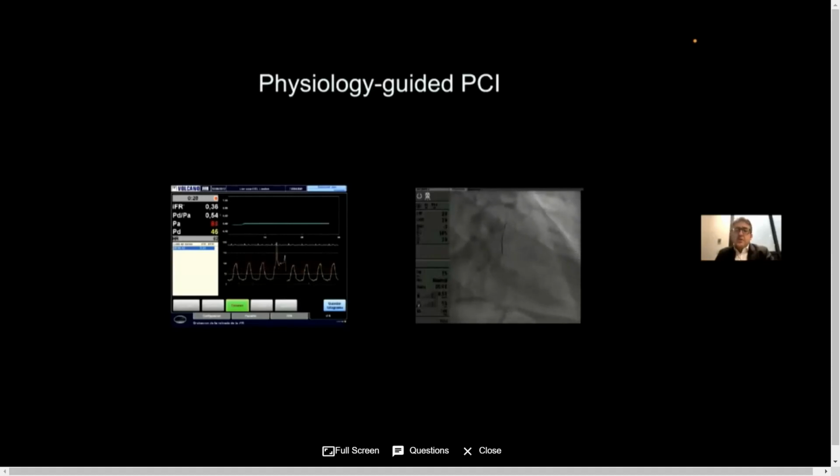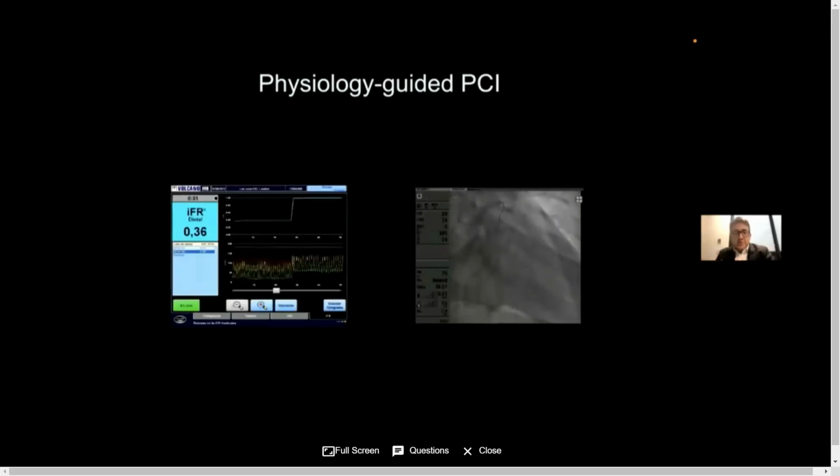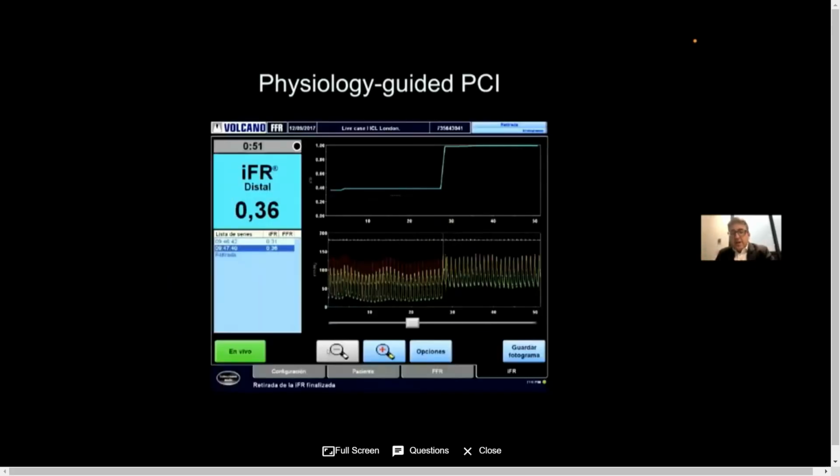So at this moment in time, we didn't know what was going on. We thought, had the system got it wrong? Was there a problem? Had it misinterpreted the pressure step-up? And we started to think, well, maybe it's the fact that the angiogram had deceived us, and what we thought was the tightest angiographic area actually wasn't. And this is a real life illustration during a live case during a physiology course, where we actually were looking at this. So, we finished the pullback.